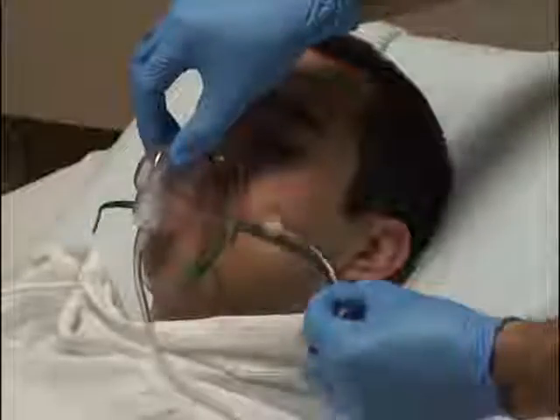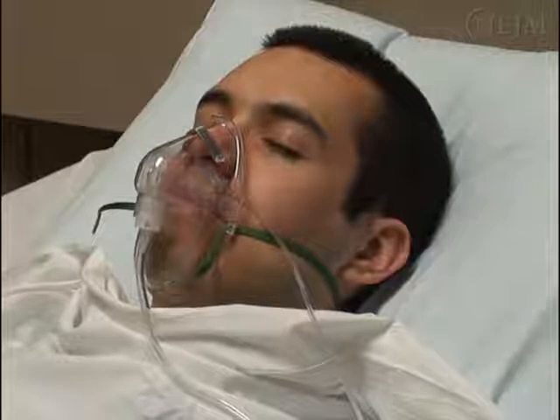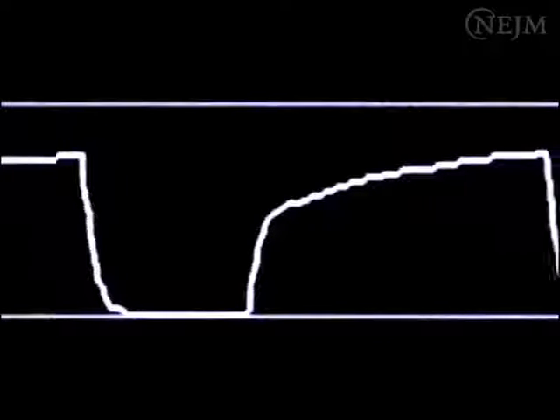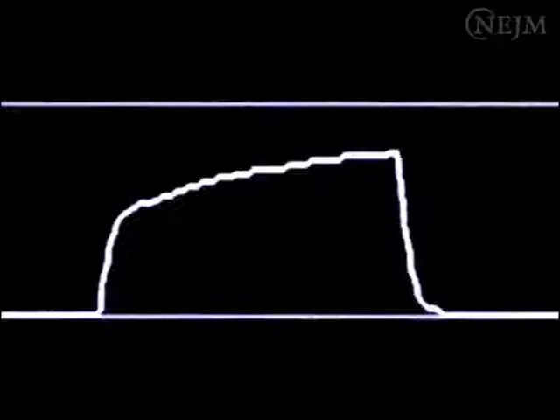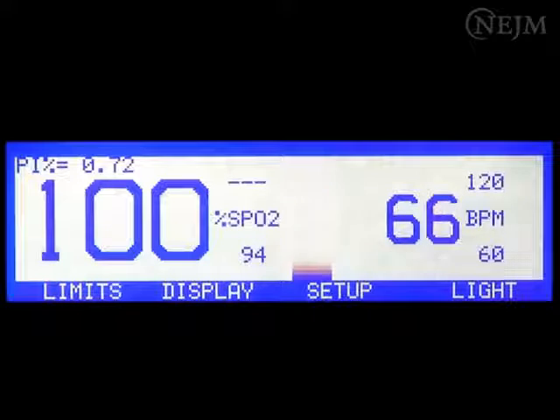While pulse oximetry is a good method for the assessment of oxygenation, capnography provides more direct information on a patient's ventilatory status. Capnography is particularly helpful in patients who are receiving supplemental oxygen, during which a normal hemoglobin oxygen saturation can be present in spite of marked hypoventilation.